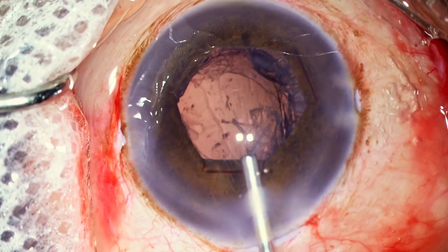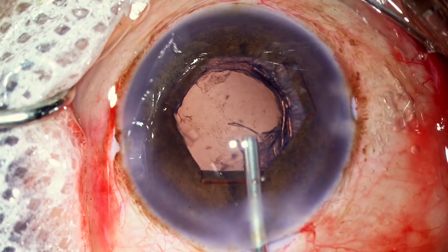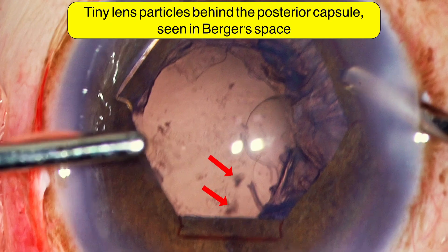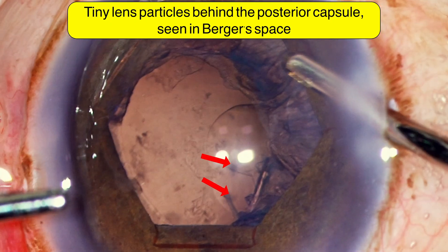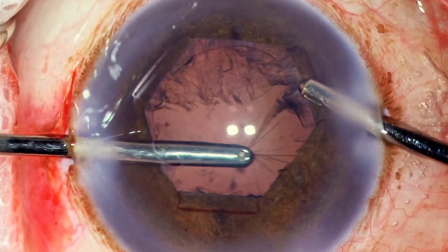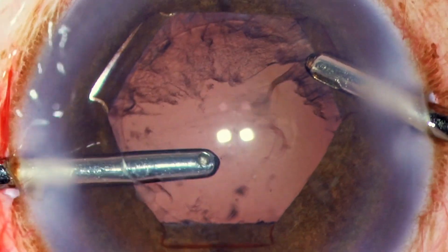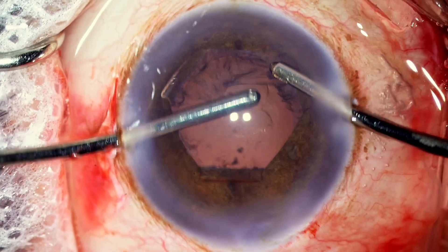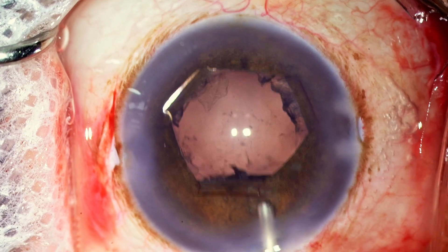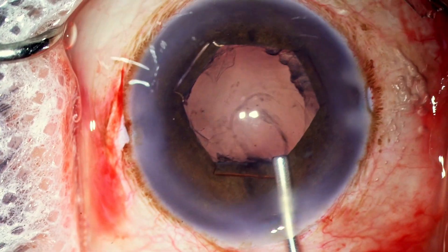The most important clue I would suggest looking for is those tiny particles floating around in the Berger's space — that should indicate that fluid has also got access, and there is always a risk of fluid misdirection happening. If I see that, I would always weigh toward fluid misdirection as the cause rather than suprachoroidal hemorrhage.